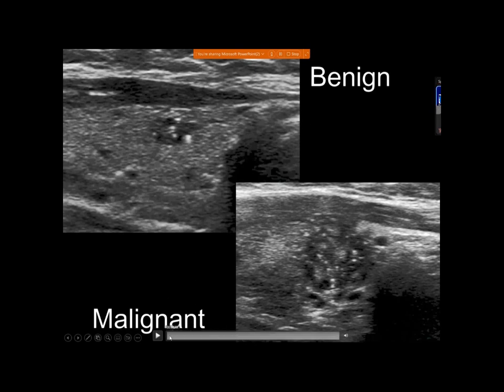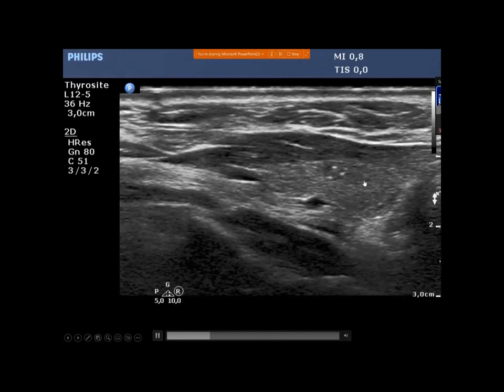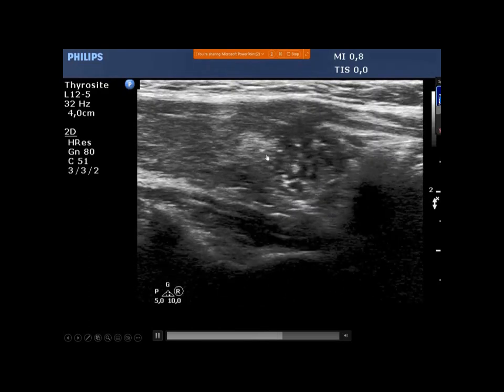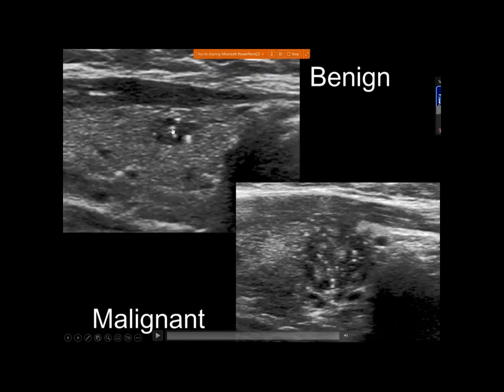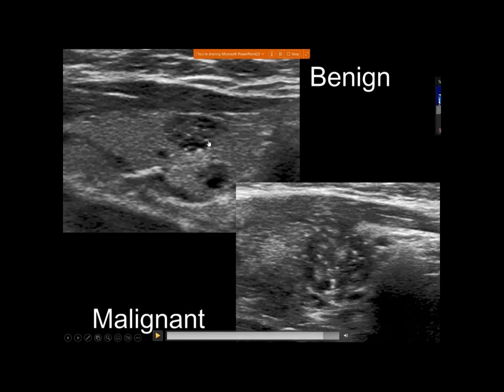So try to focus not only on the figures but on the presentation of the entire nodule: on the regular borders of that case and on the irregular, not well-defined borders of this malignant case. Naturally, such granules are ambiguous, but this is very likely a comet-tail artifact, so we have not one but more clues. But if we face that pattern, we have some doubt whether this can or cannot be microcalcifications. So the spots themselves are not fully decisive.